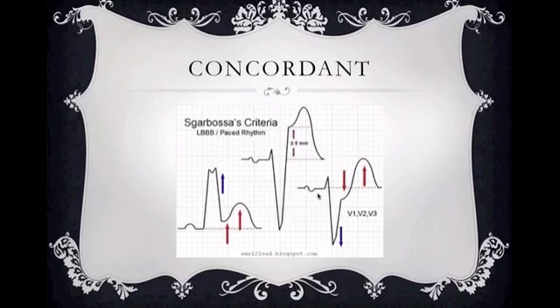All right. Well, let's look at my QRS complex here. This is a downward deflecting QRS complex with J point depression. If this is in V1, V2, or V3, Sgarbossa criteria states that this is bad. All right. This would be injury. This would be a patient who needs to go to cath.